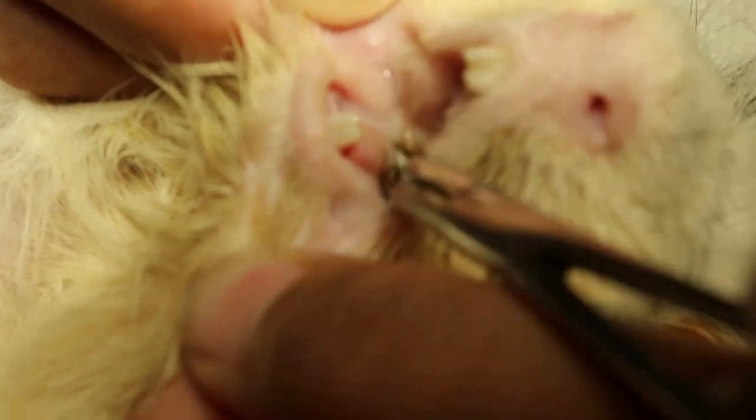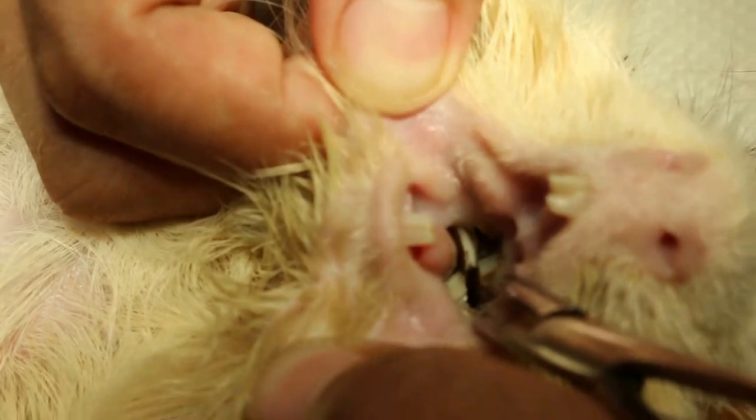Now we check further — the upper one. The upper one is okay. And then we check this side as well, the left side — upper and lower.